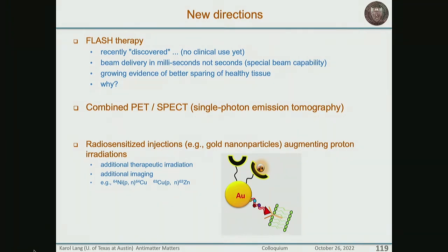The other thing is you can start combining this therapy with other use of PET to monitor what's happening after the first, second, fifth, or 25th fraction. Believe it or not, it's not happening. There are some centers that do it here and there. Doctors typically say, well, we know what's happening, but that is from statistical distributions that they typically draw from, never for the specific patient.